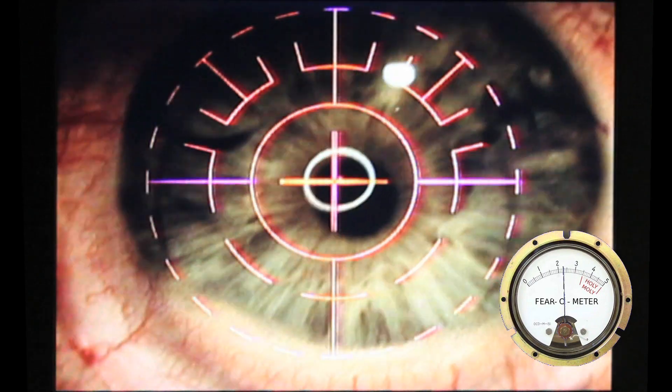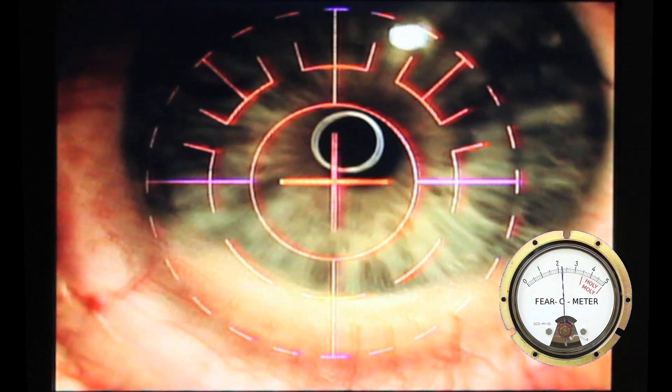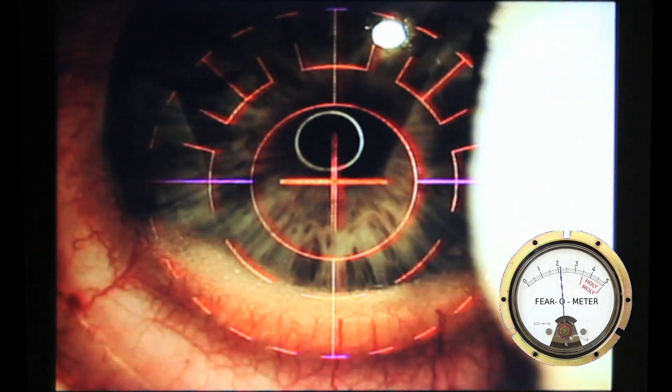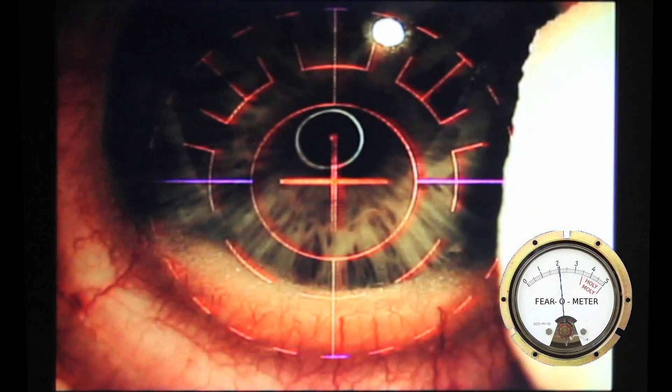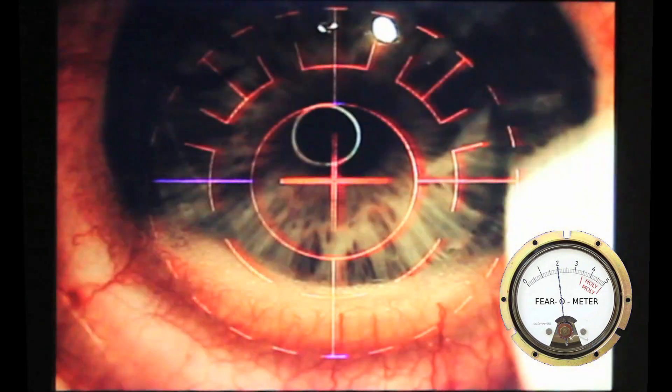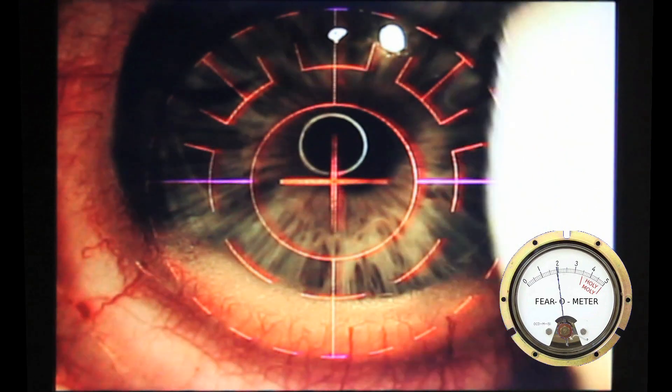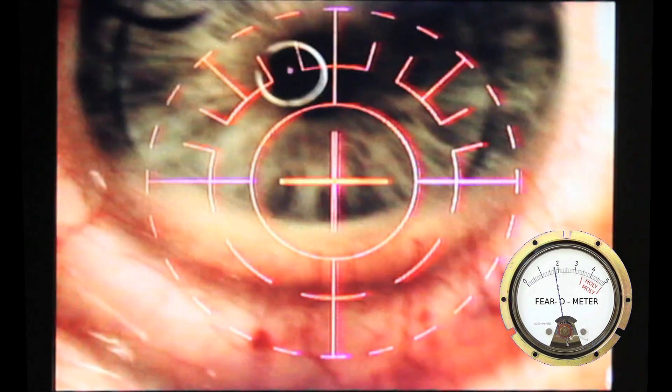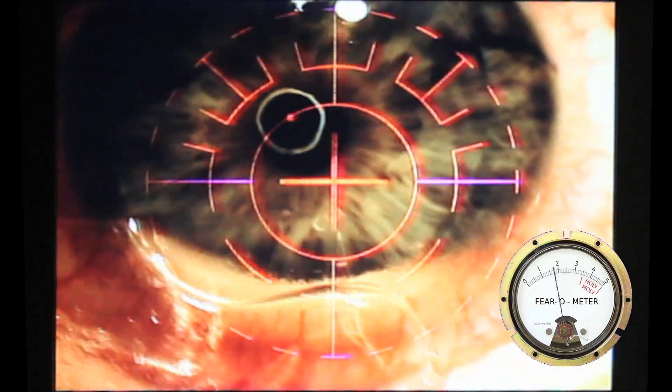So they put a drop of water back on and they laid the flap back over. And he said that the Van der Waals forces will keep it in place there. Which is some type of vacuum forces that apply on contact surfaces. And then he rakes your flap back and then puts it back in place ever so gently. And then you go to the other eye.